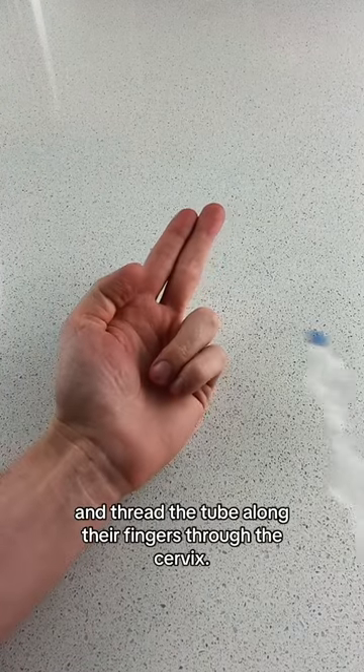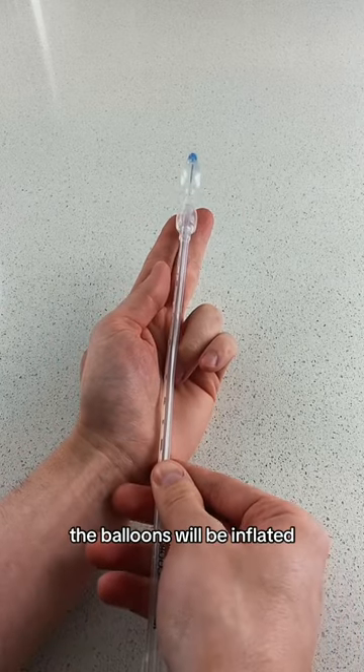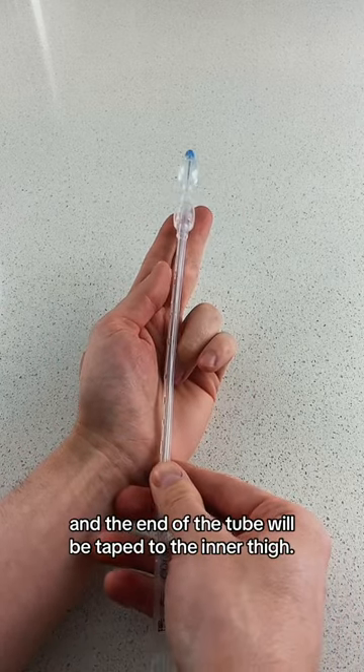To insert the balloon, they will perform a cervical exam and thread the tube along their fingers through the cervix. Once in place, the balloons will be inflated and the end of the tube will be taped to the inner thigh.